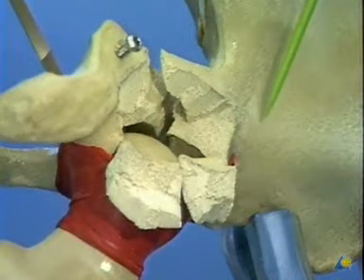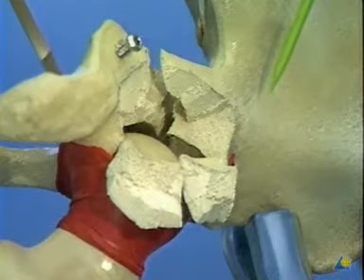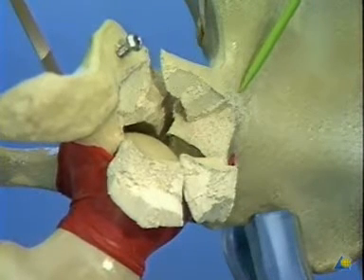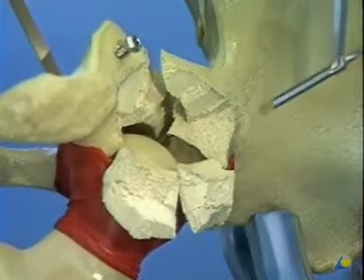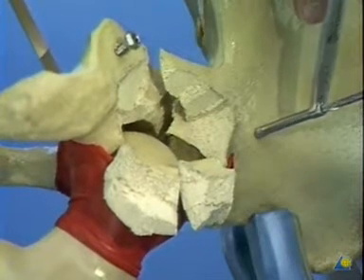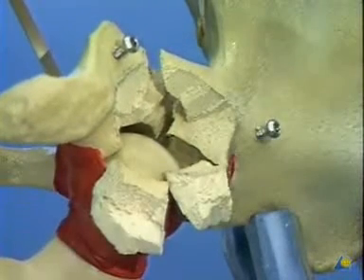Another 4.5 mm cortical reduction screw will be placed into the inferior ilium at a point anterior to where the lag screw will be placed across the transverse fracture. The hole is drilled with the 3.2 mm bit, and once again a screw 10 mm longer than the measured depth is inserted.